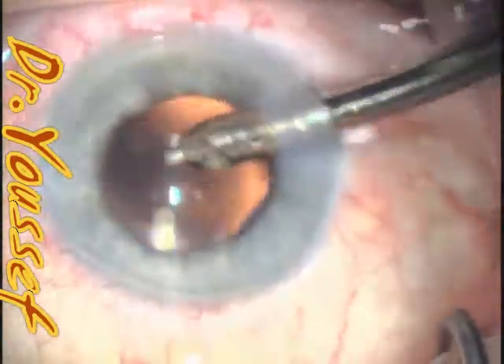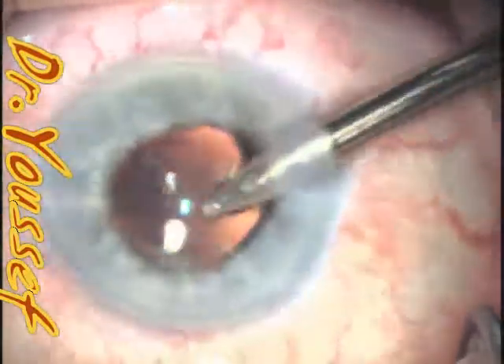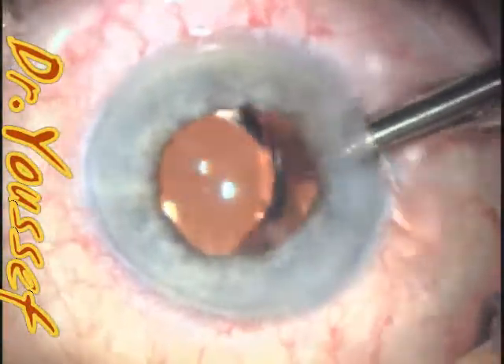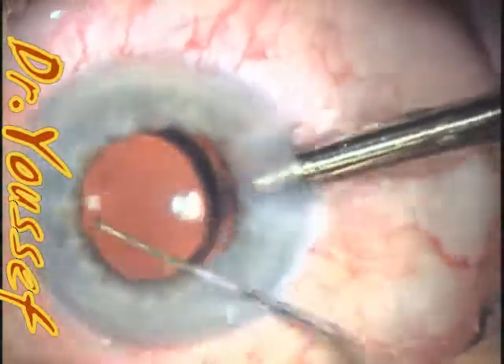The rest of the surgery is pretty routine. I'm just going to speed up through that. You can see that the lens goes into position and the pupil is okay — regular.